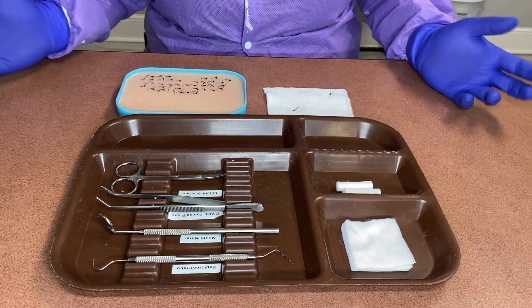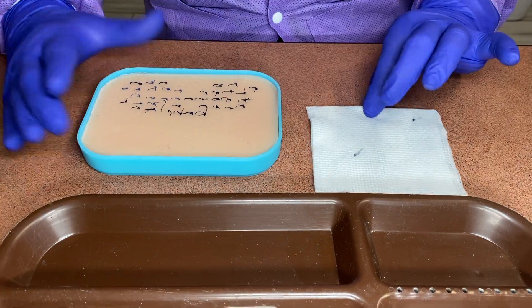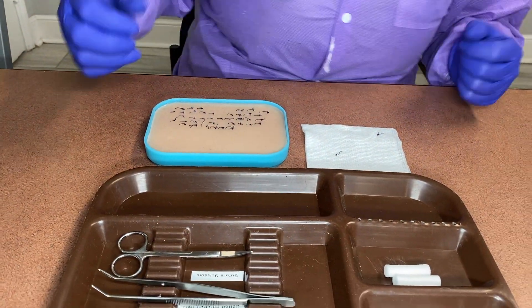Removing sutures — we have two different methods here. We have one on cotton, just a simple, easy way to do it. And then on silicone, a more tissue-like, mouth-like way, so you get more of a feel of how it's really like.